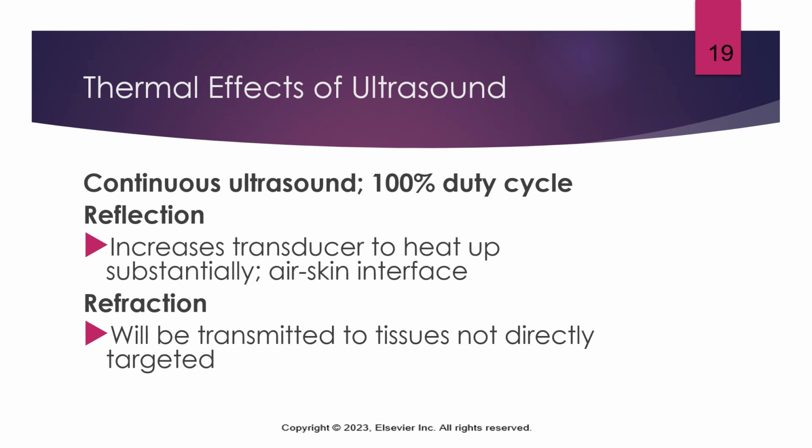So for any ultrasound application that you're going to be performing, we're going to use this nice gel on the surface of the skin and between the transducer head and the skin. The reason that we need that is because, like I was just talking about, this air-skin interface can cause reflection, which can cause those standing waves, and it can actually cause the transducer to overheat, which is obviously a burn risk. So we need to make sure that there's sufficient amounts of that gel on the skin.